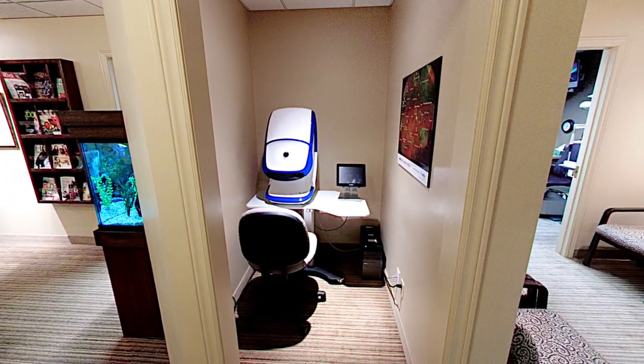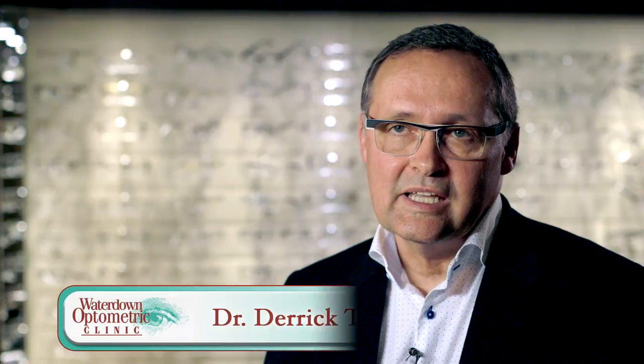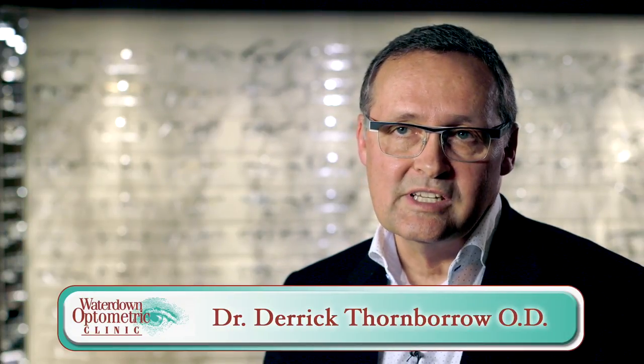The most recent version of this is the Daytona. The Daytona can take a picture of the eye at the back without using any dilating eye drops and see 200 degrees of the retina.